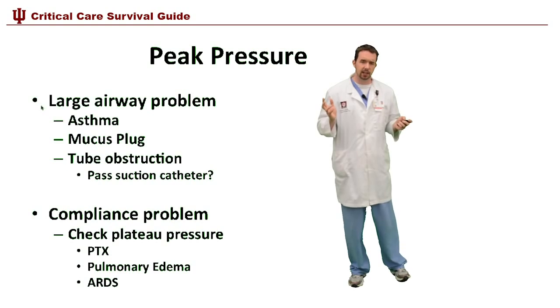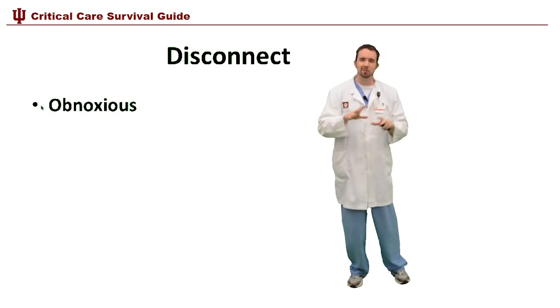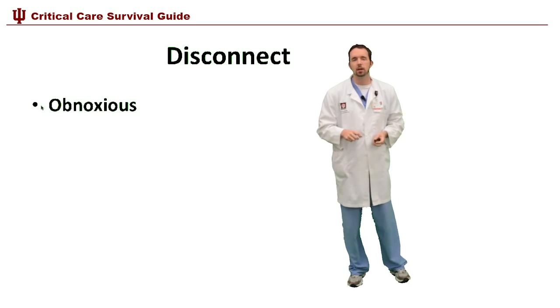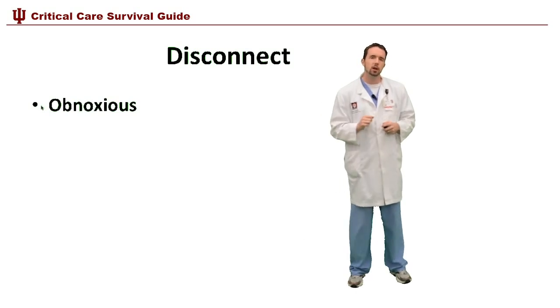What about vent disconnect? If the ventilator gets disconnected, be ready, because a very, very loud alarm is going to go off, and nurses and RTs from all over are going to go rushing into the room to try to rehook the ventilator back up. That'll be an easy alarm for you to detect, and the simple solution is just to reconnect it. Lastly, let's talk about apnea.